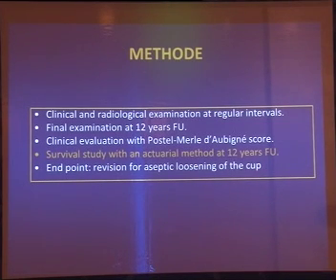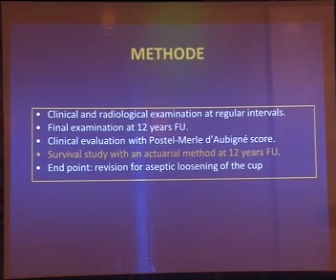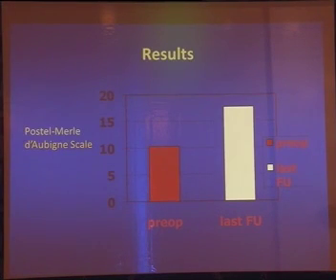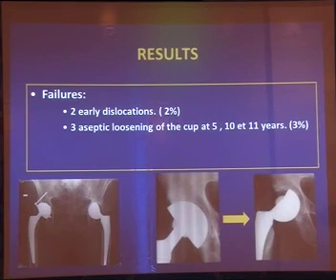Clinical and radiological assessments were regularly conducted, and a specific assessment was conducted at the last follow-up for this study. The radiological evaluation was performed using specific radiographic analysis software, and four parameters were analyzed: horizontal cup migration, vertical cup migration, cup inclination, and femoral head coverage by the acetabular cup, in order to evaluate the overall wear of the acetabular cup. The mean Postel Merle d'Aubigné was 10 preoperatively and 17 postoperatively.